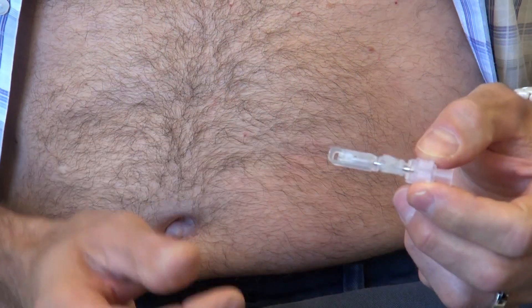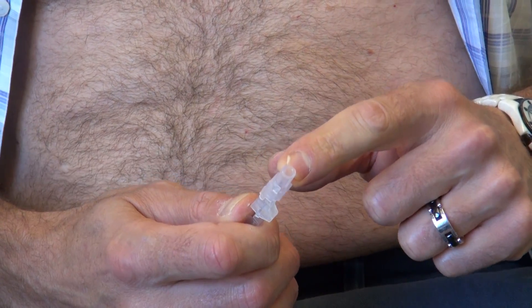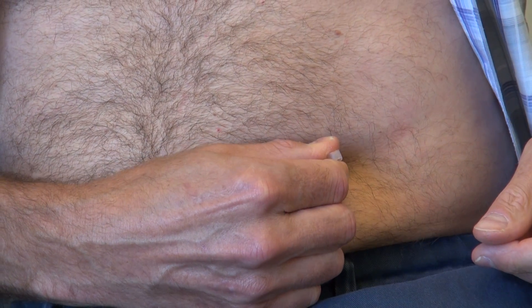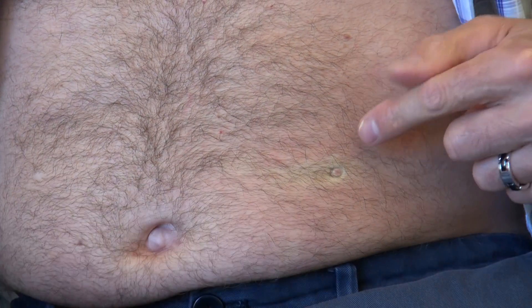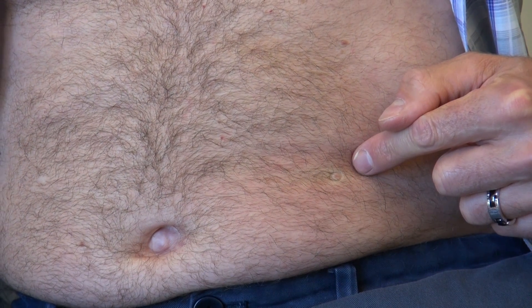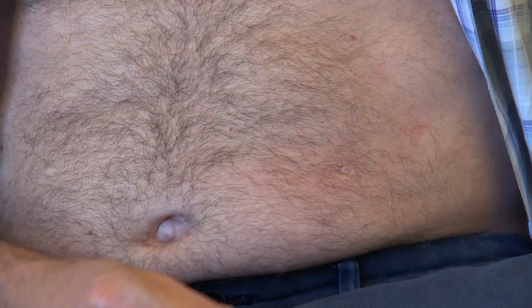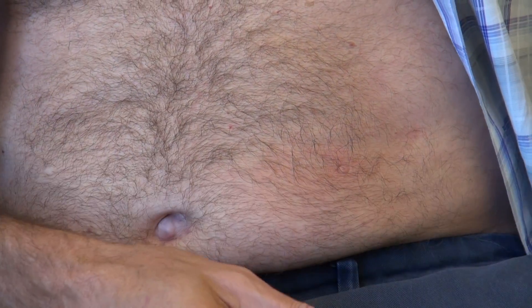Use the threaded end of the needle cap to make a dot on the abdomen — press it firmly into the skin and it'll leave a little round circle. That's a nice target so you know where to wipe with the alcohol swab. Clean the spot with three swabs, starting in the middle and going around in a circle getting a little bit larger each time. Do that three times.